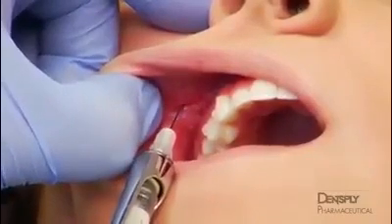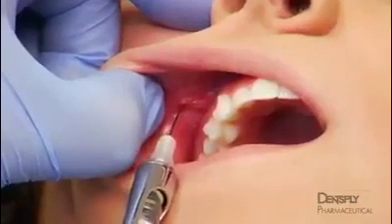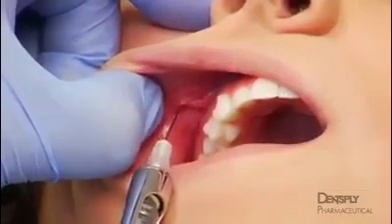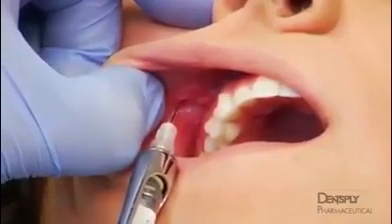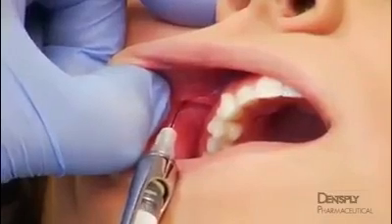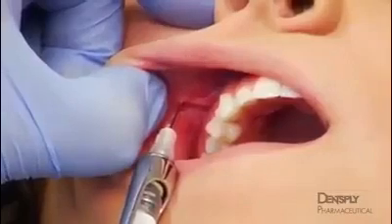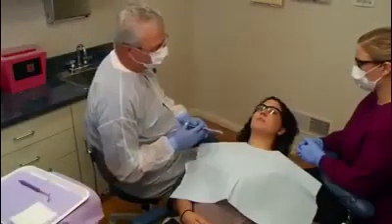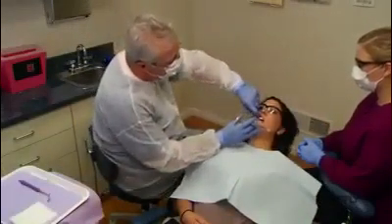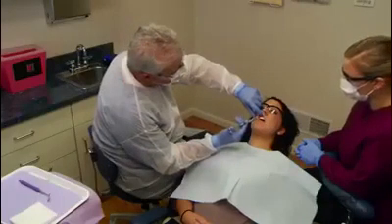The average depth of penetration is about 15 millimeters. After negative aspiration, injection is made with the palpating finger remaining in place to help guide local anesthetic solution into the infraorbital canal. A total of 1 milliliter, or about 1/2 of a dental cartridge, is injected slowly. As with all other injections, the needle is then slowly withdrawn and recapped. Because of crossover fibers from the contralateral side, anesthesia of the central incisor may be incomplete unless a supraperiosteal injection is made over that tooth.